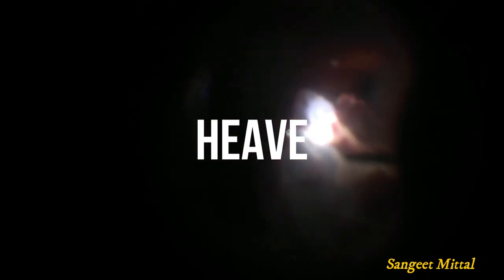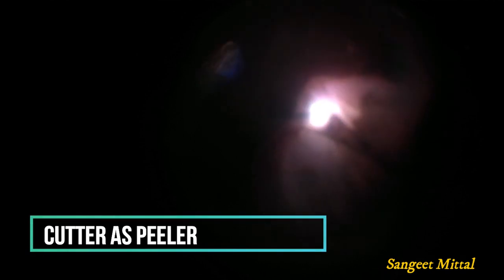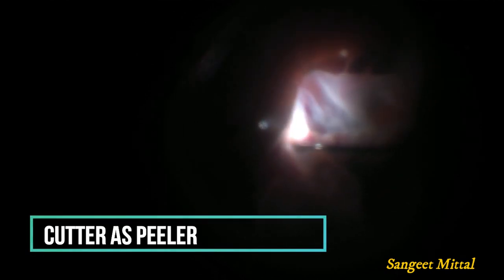Sometimes the subretinal sheet is too thick and adherent to the retina. This sheet is quite thick and heavy to be removed by end-gripping forceps. The vitrectomy cutter can be used to grasp the subretinal band at the posterior edge and peel the sheet en masse.